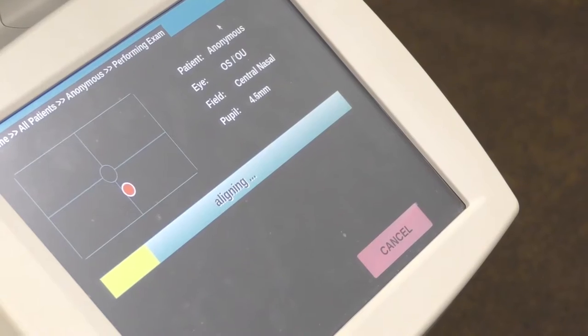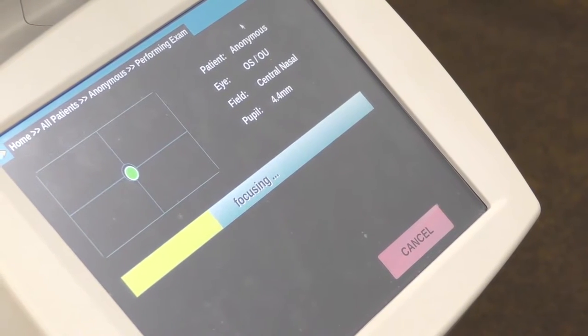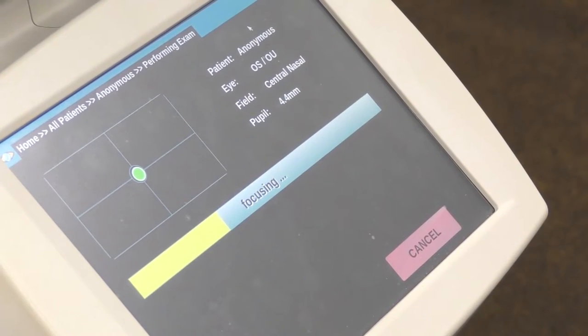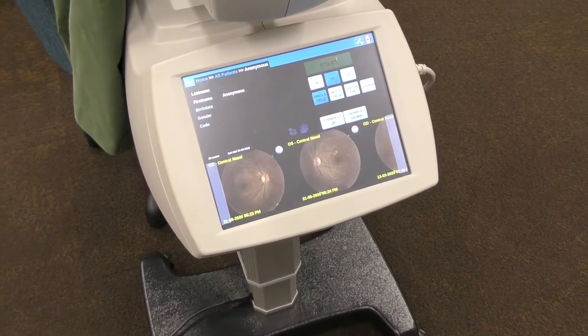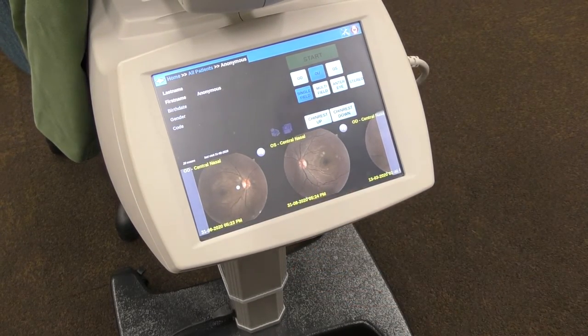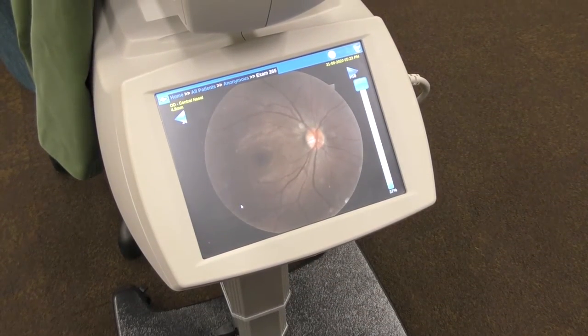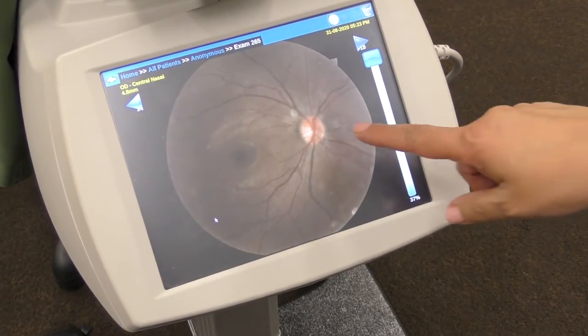Here you can see the system searching for the pupil — the pupil diameter is measured as 4.4mm. Once both photographs are taken, the images appear on the monitor and you can select the one you want to bring up on screen. We'll now gather around and talk through the structures.